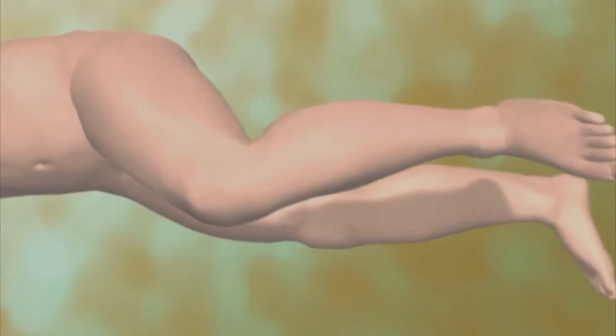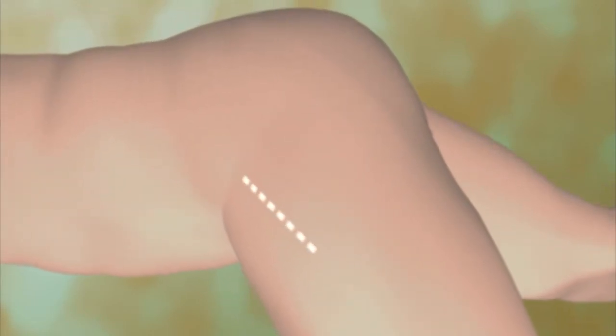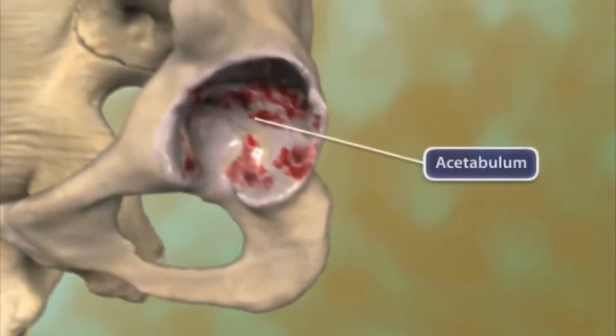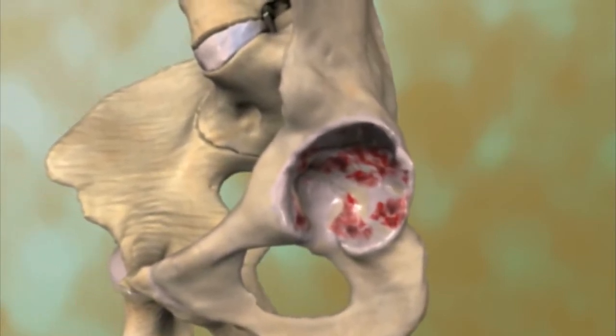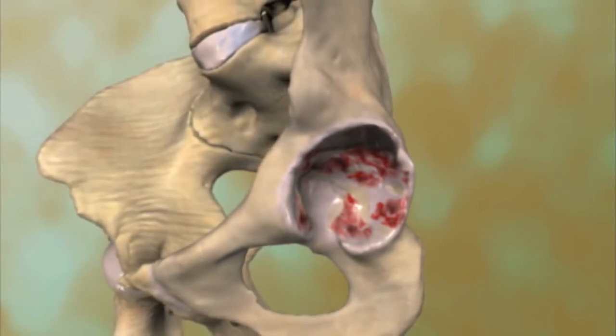Total hip arthroplasty, also called total hip replacement, begins with an incision to allow access to the bones of the hip joint. The next step is to remove damaged cartilage and bone from the acetabulum, the cup-shaped hollow in the pelvic bone. This damage results from the bones rubbing directly against each other when protective cartilage wears away.